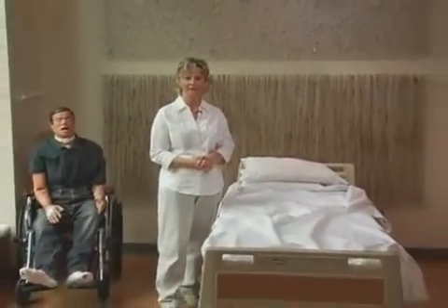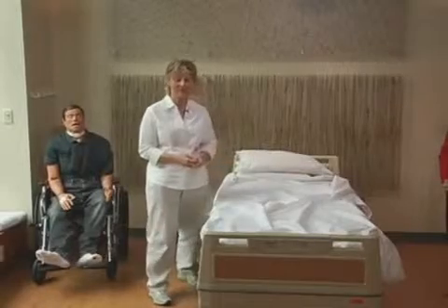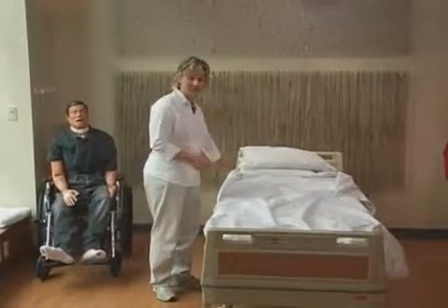I work in home health, and today we're going to be teaching you how to do some transfers. We're going to be doing bed transfers with a draw sheet, and then we're going to be getting our patient in and out of bed to a wheelchair. We start with the draw sheet.